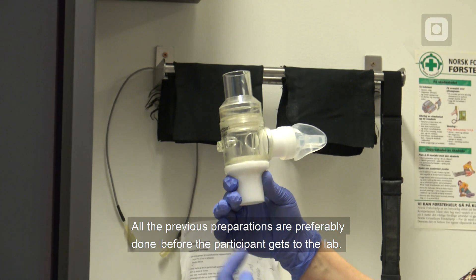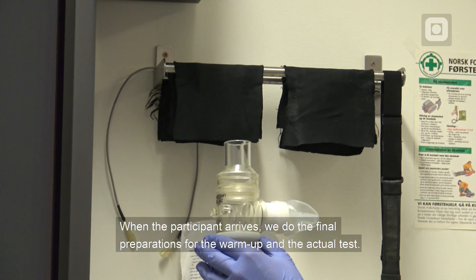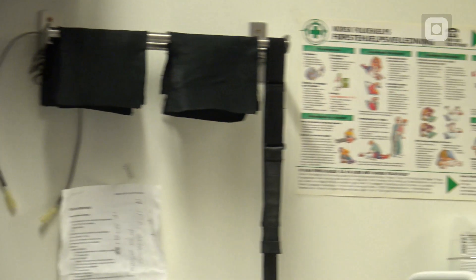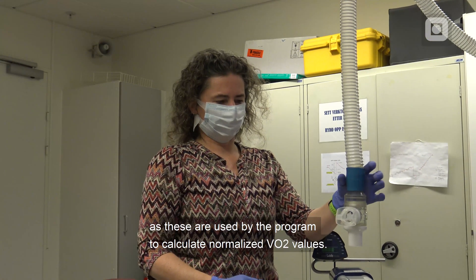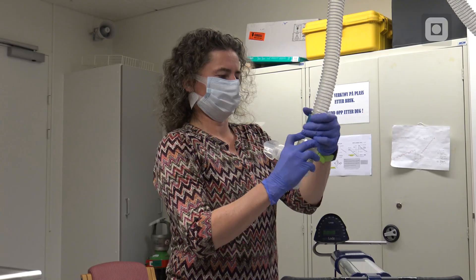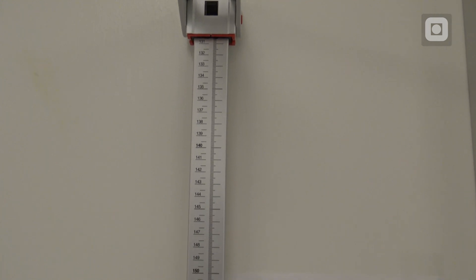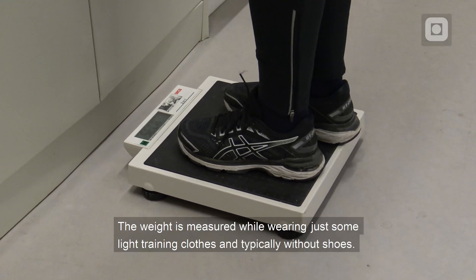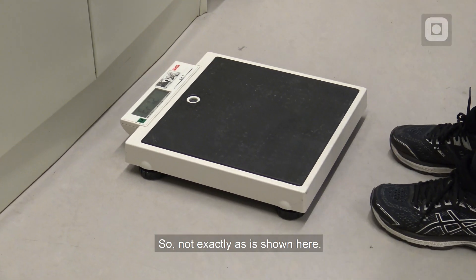All previous preparations are preferably done before the participant gets to the lab. When the participant arrives, we do the final preparations for the warm-up and the actual test. After informing our participants about the procedures, we measure height and weight, as these are used by the program to calculate normalized values. Height and weight are always measured in the lab to minimize measurement errors. The height is measured with a stadiometer for more accuracy, and weight is measured while wearing just some light training clothes, typically without shoes.